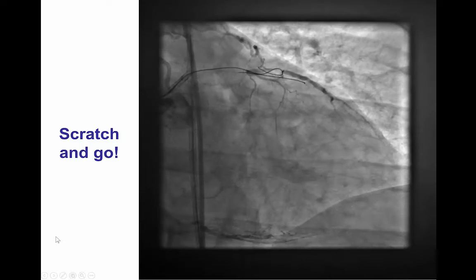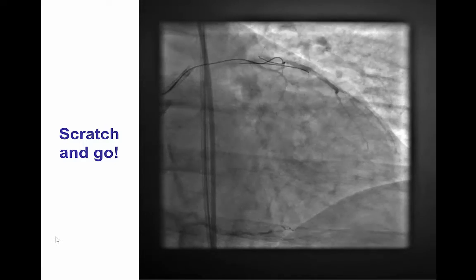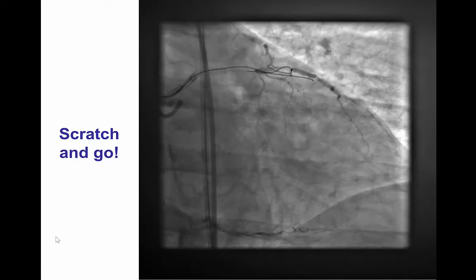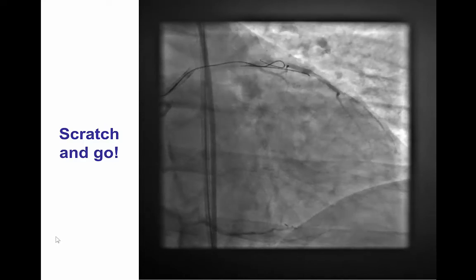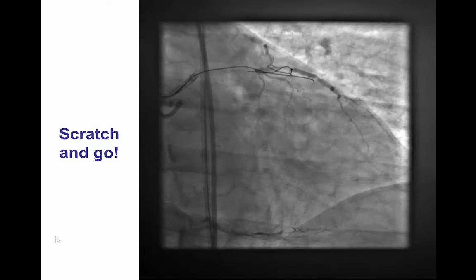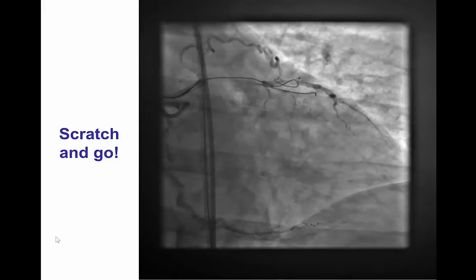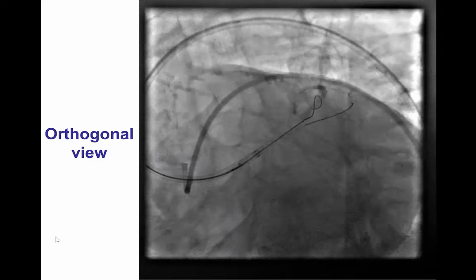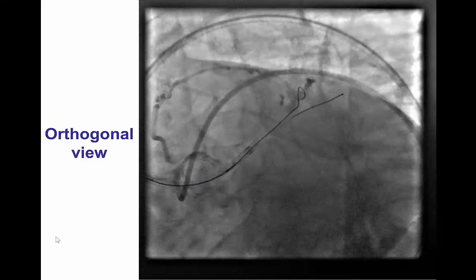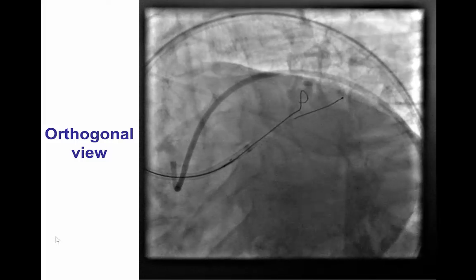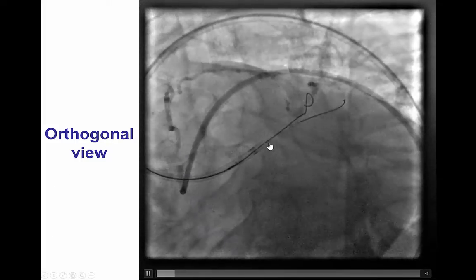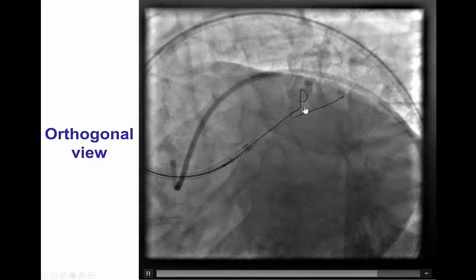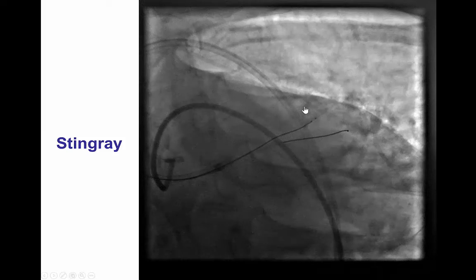This is an example of a technique called scratch and go, in which case when there is proximal cap ambiguity, creating a small dissection proximal to the occlusion can help track the vessel and advance past the occlusion. This is confirmed in another angiographic projection, showing that the loop we have is indeed moving in sync with the course of the left anterior descending artery.